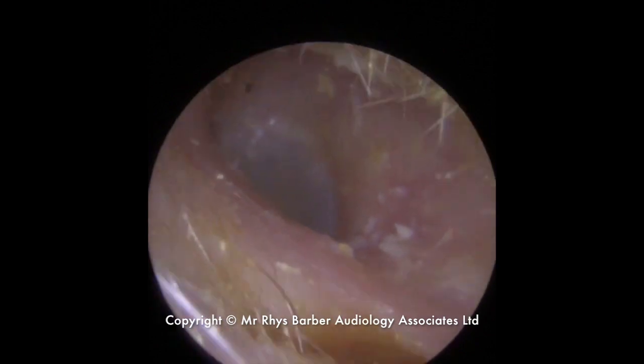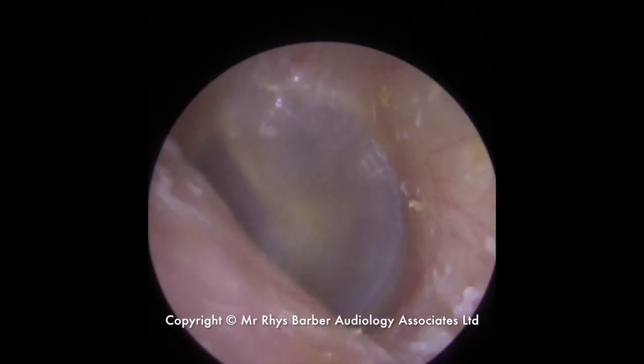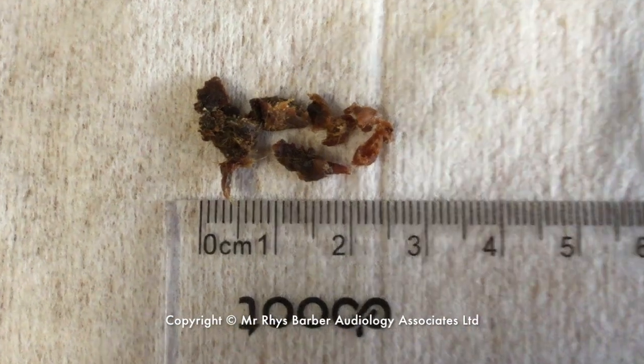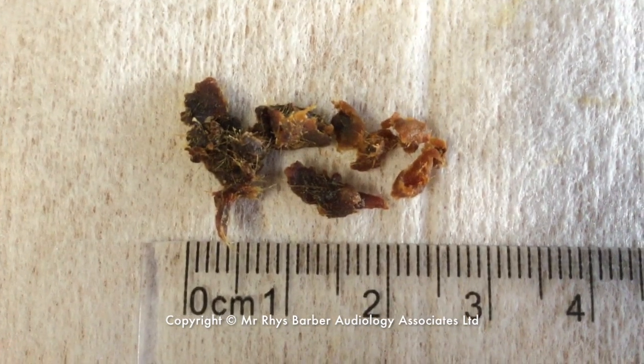When we go in to take a look now, we've got a lovely shiny eardrum. All looks nice and healthy in there, no wax left, so it's all looking very good. You can see these much harder, darker pieces of wax there, so it's indicative of it being in there for a little while.